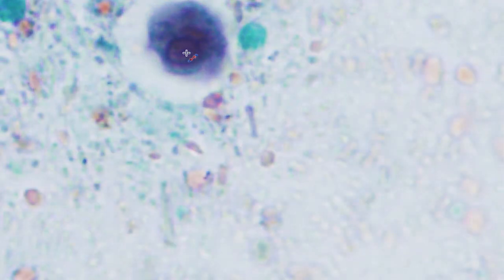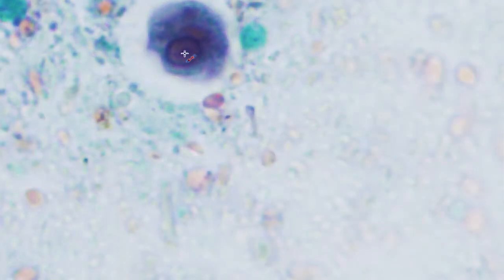A nice central karyosome. This one's become a little bit diffuse. That's probably because it hasn't been preserved immediately. If you don't preserve your entamoebas soon after passage, the trophozoites start to break down. One of the first things to happen is that the karyosome becomes much more diffuse and wide and looks a bit more like an E. coli karyosome, in that when you have really freshly preserved samples, they have very lovely, tight, small karyosomes. So that's another thing which you can come across as an issue.